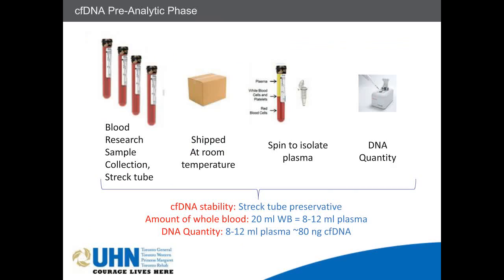So as we began looking at cell-free DNA, this slide just shows an overview of our approach at Princess Margaret Cancer Centre to the pre-analytic phase of cell-free DNA. So we do collect the blood for cell-free DNA in Streck tubes, and I'll speak a bit more about that. So those research samples are collected in Streck tubes. Streck does allow a stabilization of the cell-free DNA, and so the samples can then be shipped at room temperature, which makes sending of samples between sites much easier.